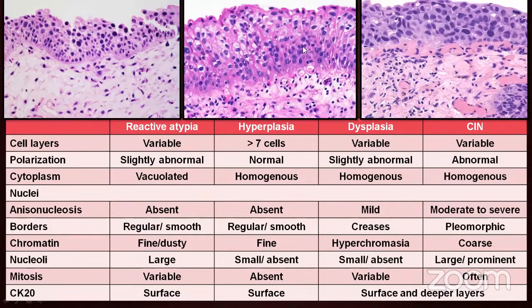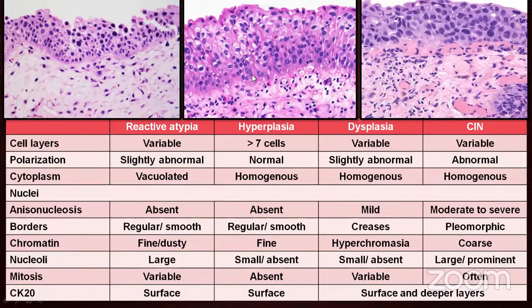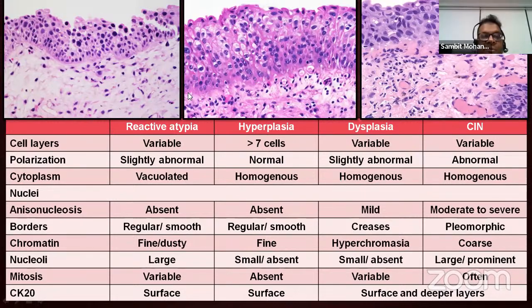What did you say? They look a little enlarged, nuclear megaly with nucleolar prominence, but are they pleomorphic? They are not pleomorphic. They are not aligned. Yes, very good. They are not aligned perfectly to the basement membrane. They are kind of making a bunch of nuclei in one place and another with some nuclei-free zone. But the nuclear chromatin is alike.